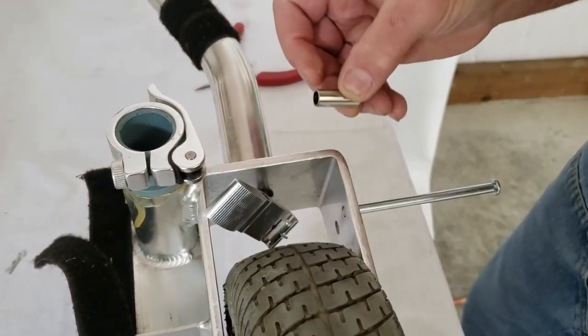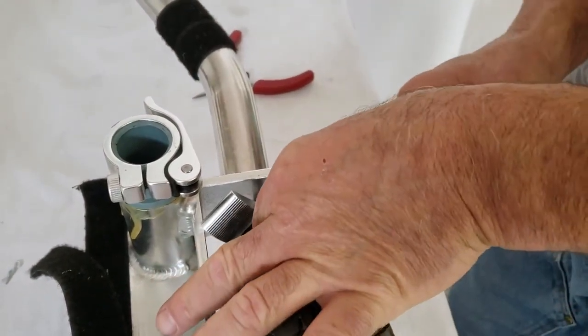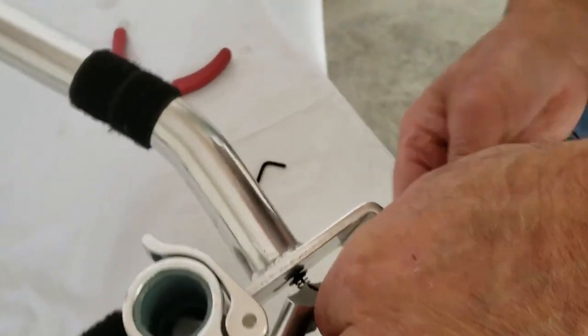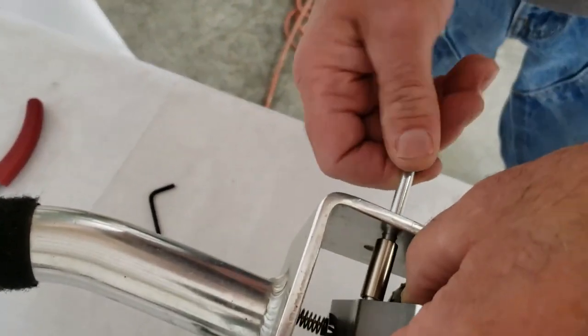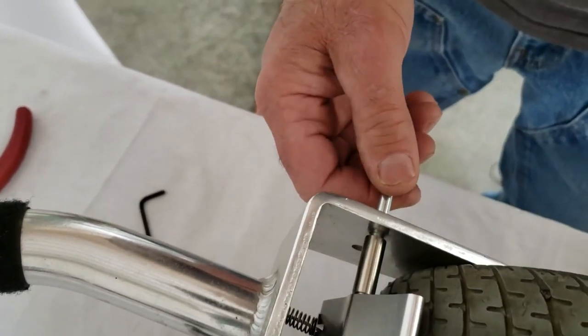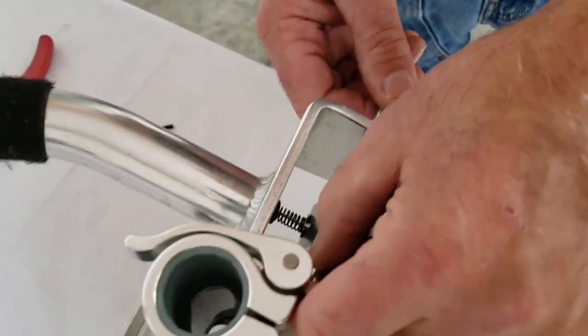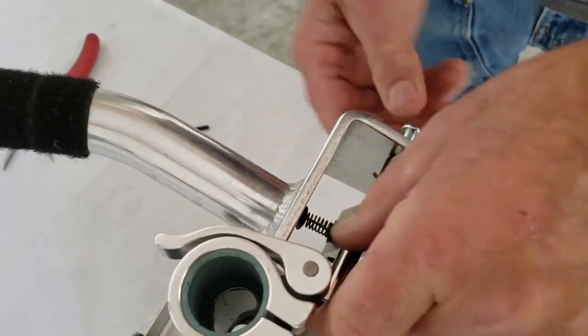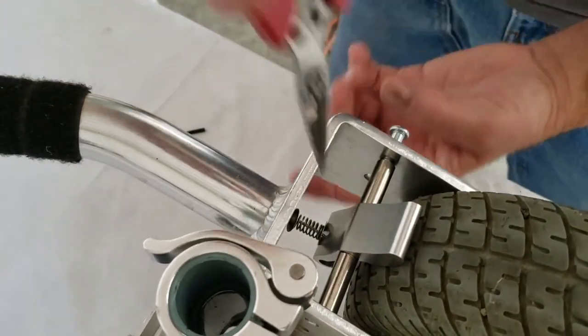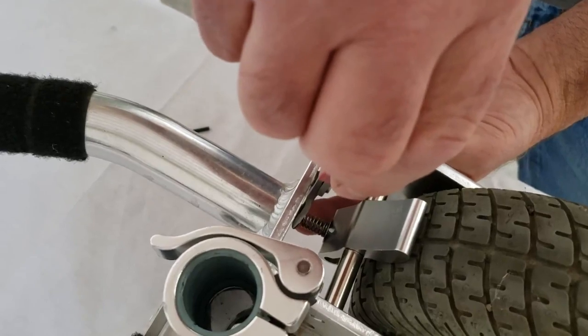You want to have this shorter spacer towards the outside of the fork. Run it through the axle shaft. And this longer spacer goes on the inside.